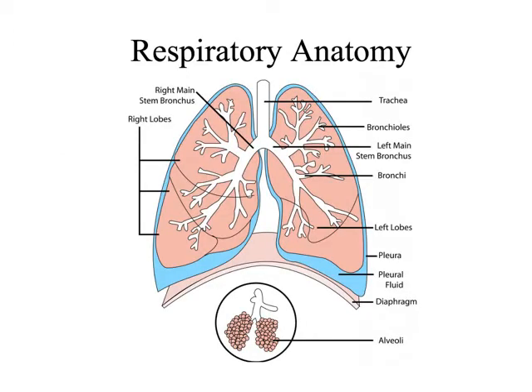So, in terms of respiratory anatomy, we need to be familiar with the appearance of the trachea on our CT images, and also be able to identify the right and left main bronchus. How those are going to show clearly on our images is that we will see a rim of cartilage, a circle of cartilage around a black spot of low attenuation due to the air there.